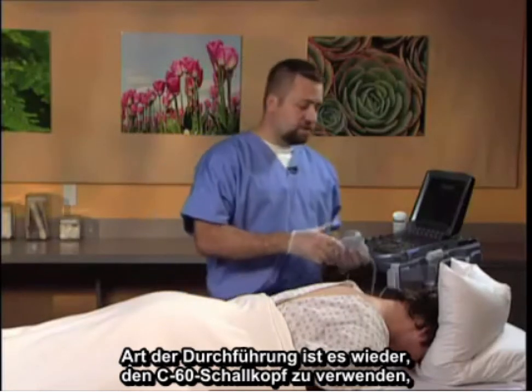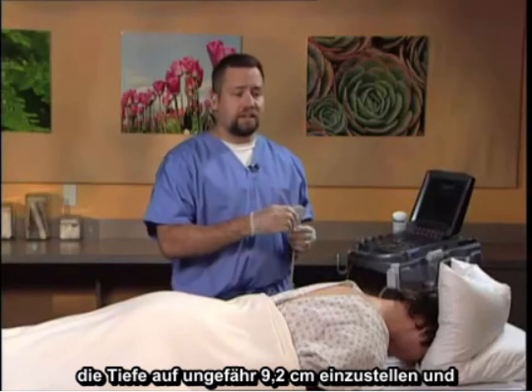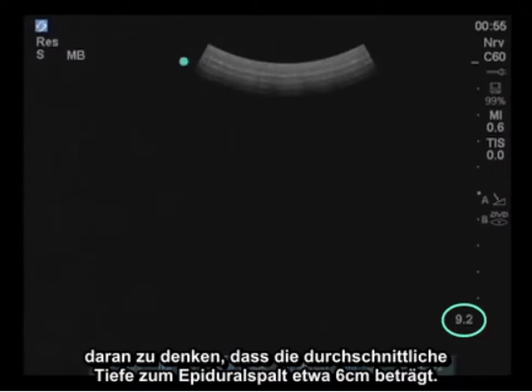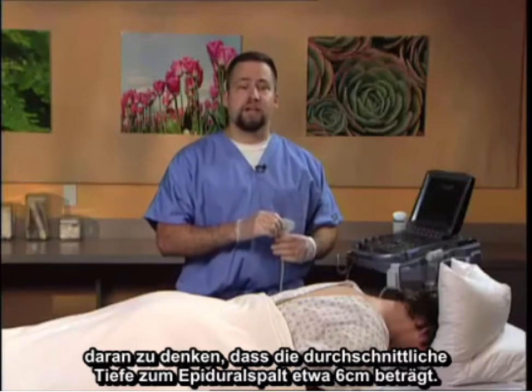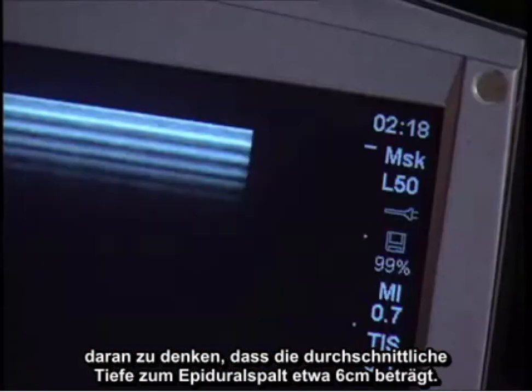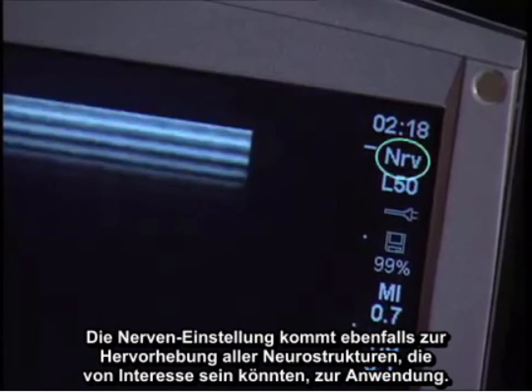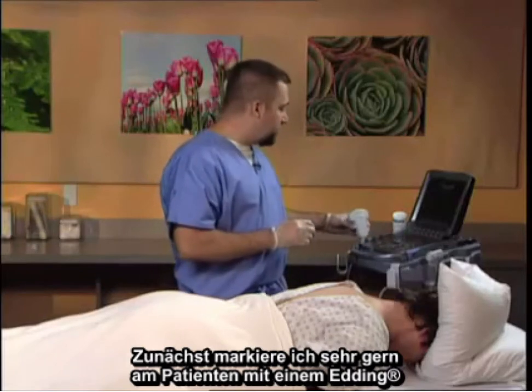This is performed utilizing the C60 probe, setting the depth to approximately 9.2 centimeters, remembering that the average depth to the epidural space is approximately 6 centimeters. The nerve setting will also be used to highlight any neural structures that may be of interest.